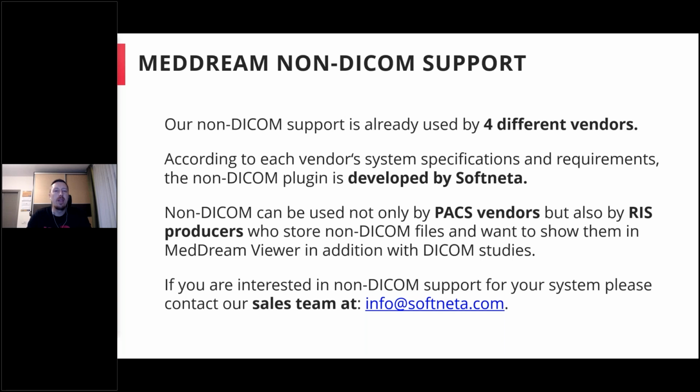And this plugin is developed by Softneta according to each vendor's system specifications and requirements, because some have other workflows for how these non-DICOMs should be displayed. So we are taking notes on this, and we developed 4 different plugins for these vendors.